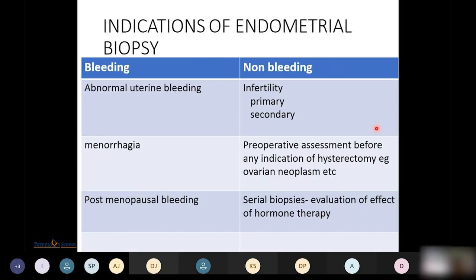There are various indications for performing an endometrial biopsy, divided into bleeding and non-bleeding causes. Bleeding causes include abnormal uterine bleeding, menorrhagia, and post-menopausal bleeding. Non-bleeding causes include secondary and primary infertility. Serial biopsies are done for assessment of endometrium when the patient is on hormonal therapy, and biopsies are also taken before doing a hysterectomy, such as when there is an ovarian neoplasm.